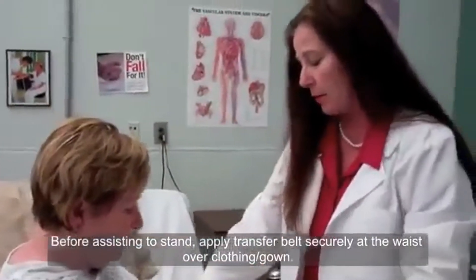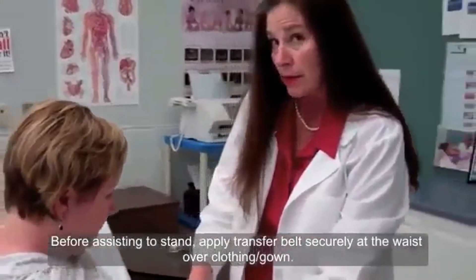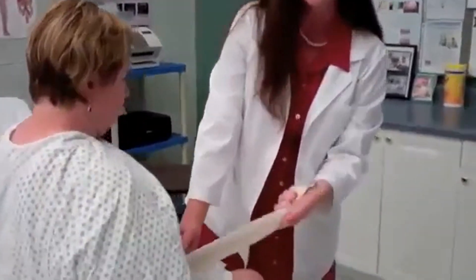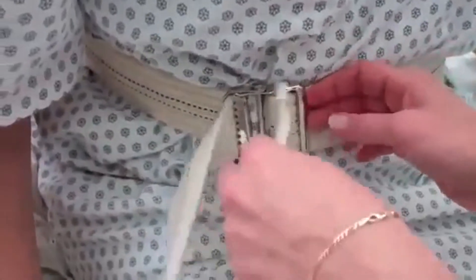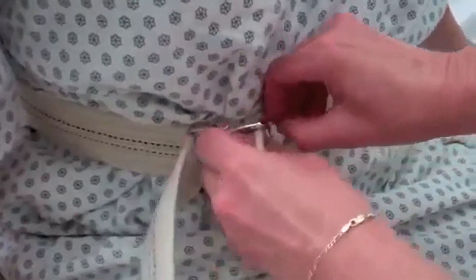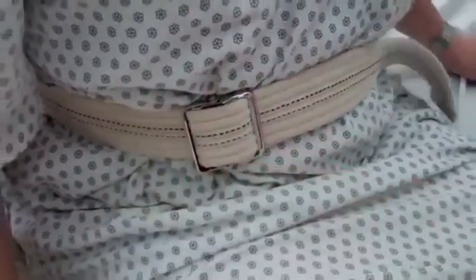It does have to remain snug, however, for safety. Now, if you notice, what I am doing is I am putting this over the teeth first, and I'm putting it off to the side. That is snug, I realize, but we will go ahead and make it looser. It comes through here. Is that okay? That's fine.